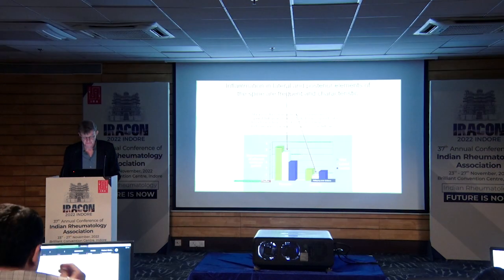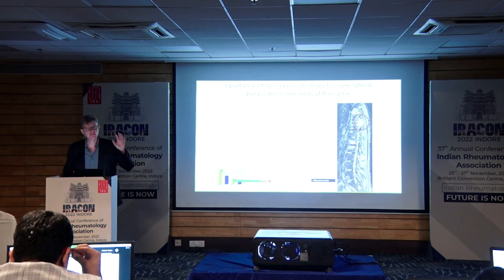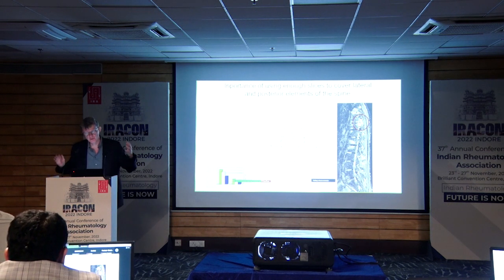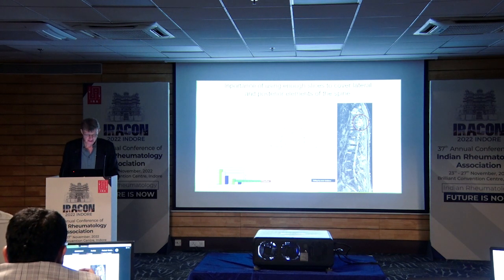So that was the wrong direction. And this slide just illustrates, I'll skip it, but let's say that it's quite important, it's quite frequent, it happens as frequently as the vertebral body thing. So it's important also to look at the posterior areas like this. And here are all the different areas you can look at, and that can be done, and we have a scoring system for that which we will use. But it's important that you look for the lateral things.